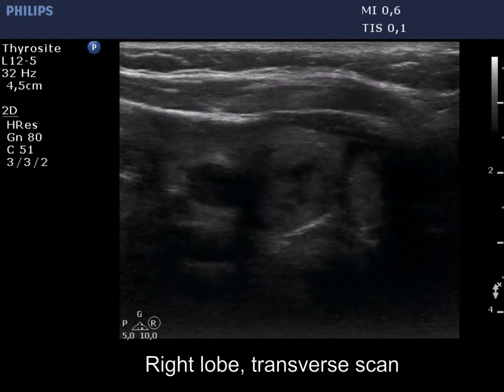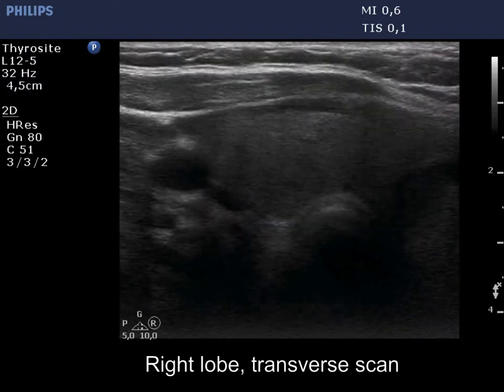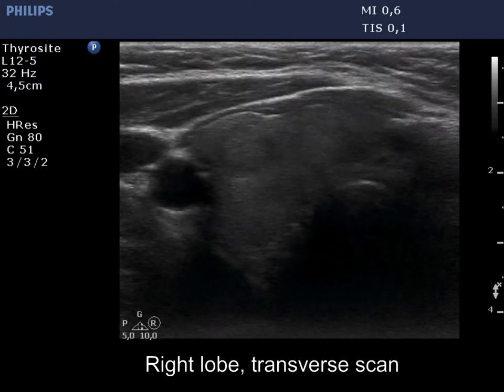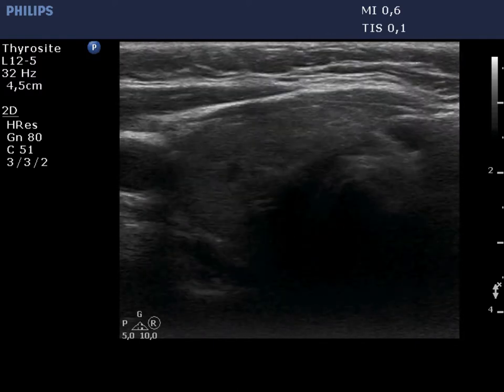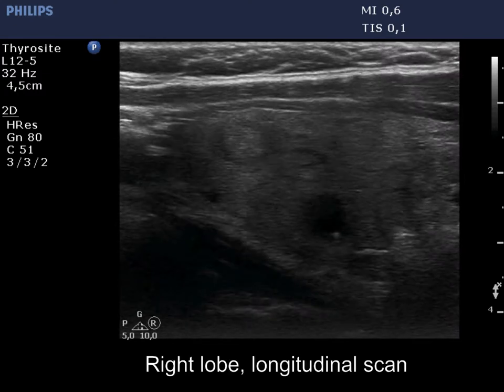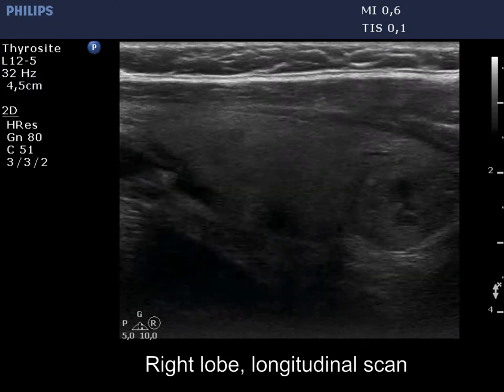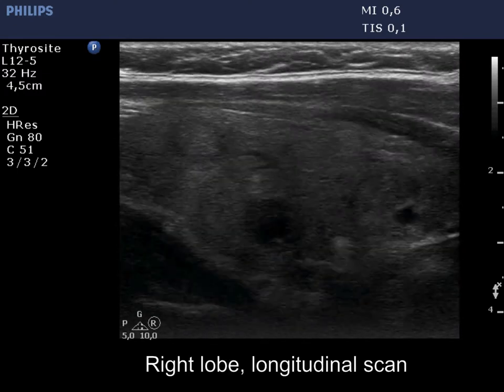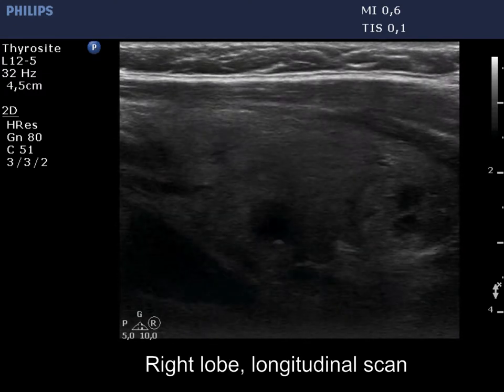The right lobe is minimally hypoechoic and has several discrete lesions. The lower pole is just visible.